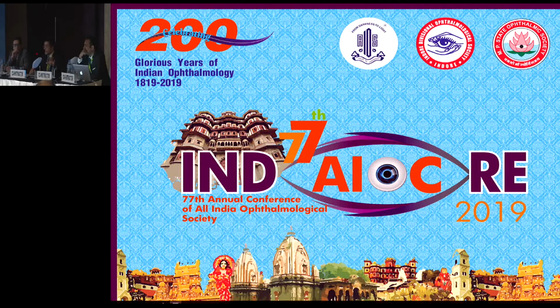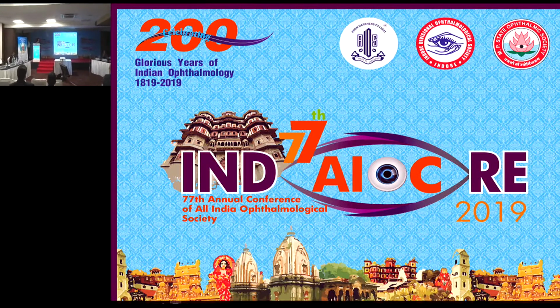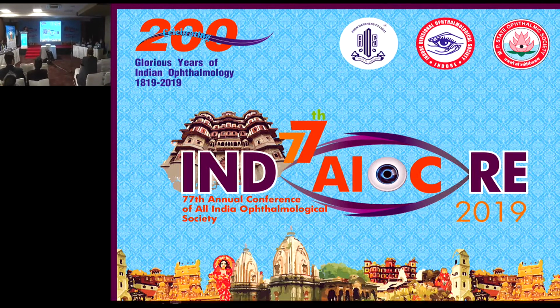Exactly. So once you give him a slit lamp examination, you can make out whether he has a DME component, as in CSME or not. And if we think that it's a CSME that needs to be treated, we are still performing fluorescein angiograms rather than an OCT. So you'll do an angiogram for the first visit? Yes, and subsequently follow up as per what the angiogram reveals. The reason we are asking questions is because she has to go and present a paper, so she will be leaving us and join us a little later again.